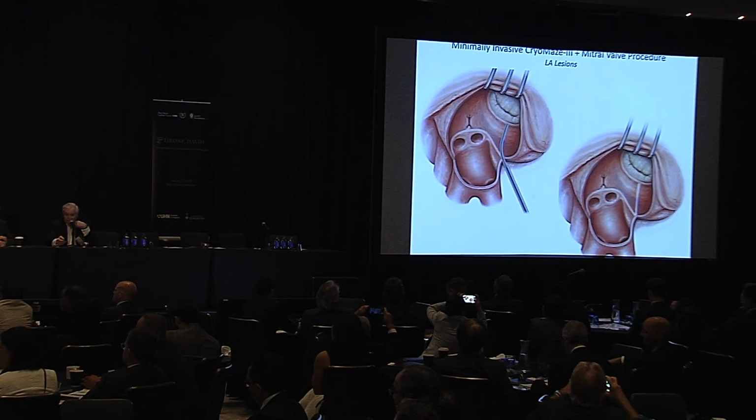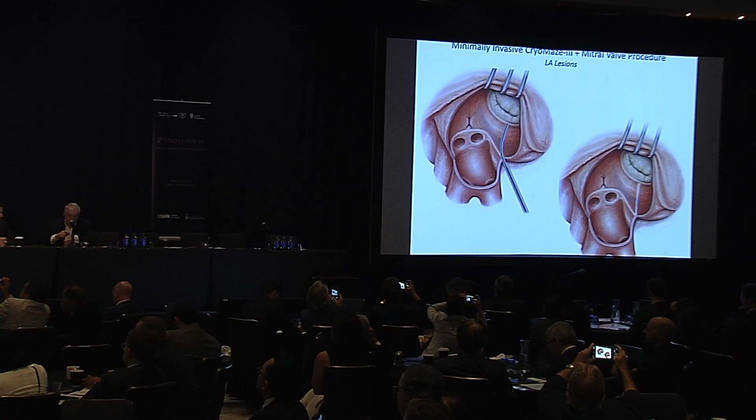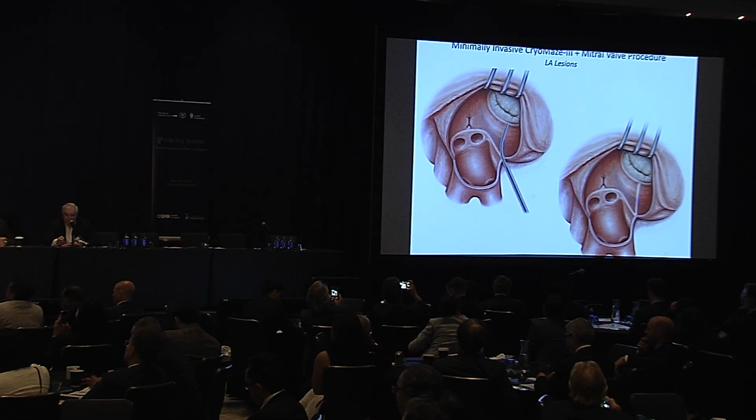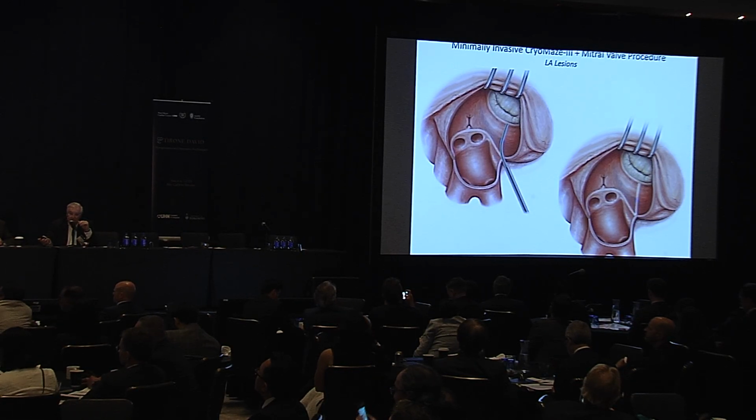And you put that in with a probe from the lower end of the atriotomy down to the mitral valve, and you put it directly across that blue dot. So now you know you've got your coronary sinus lesion in exact alignment with the mitral annulus, which is absolutely critical to the operation. And you're through. I mean, that's it on the left side.